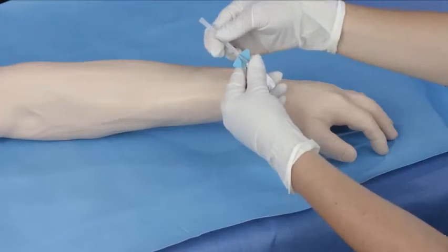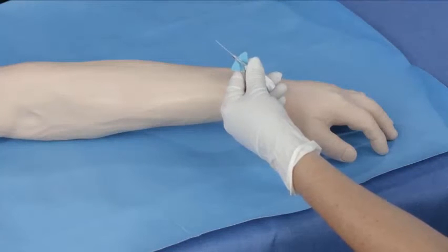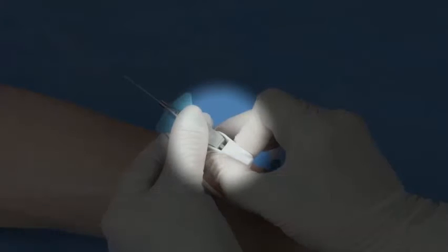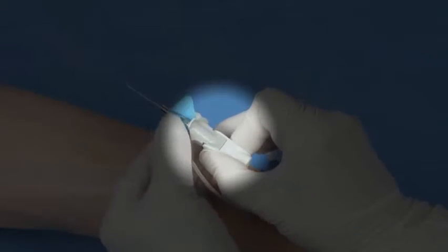Twist to remove the needle cover. Holding as shown, pull back on the white finger grips about one-eighth of an inch, then push them back together to their original position, making sure the colored platform and the white finger grips are snugly together.